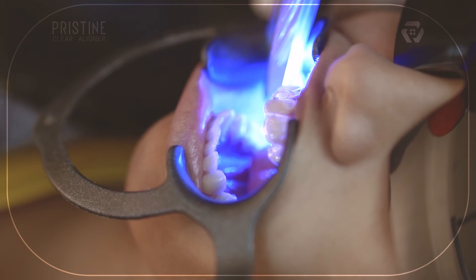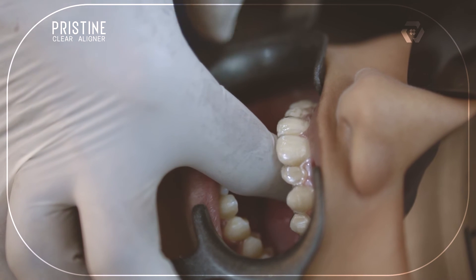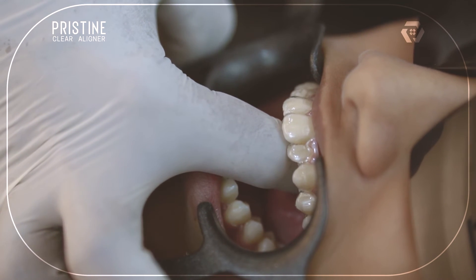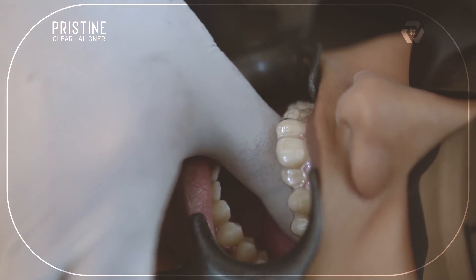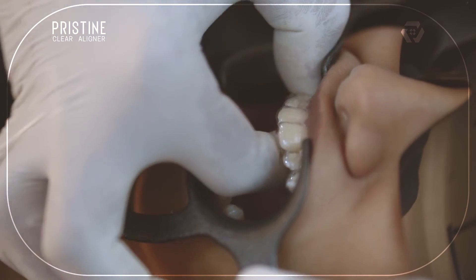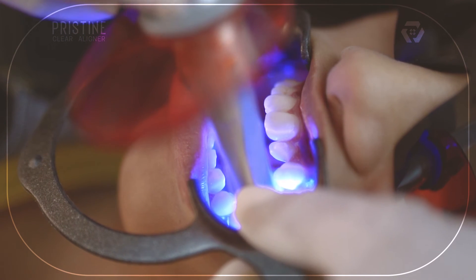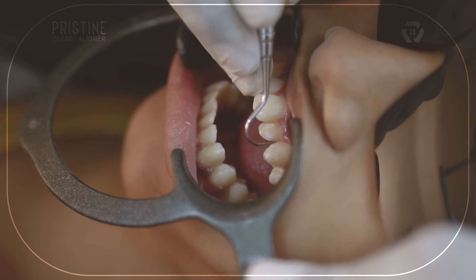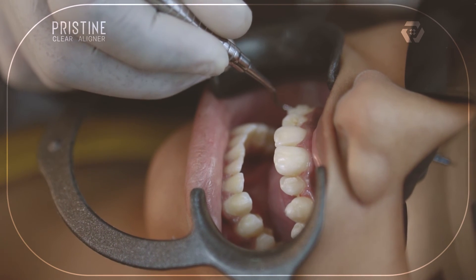Now cure it. After curing, start removing the template from the posterior-most area and from the palatal or lingual side. The softer sheet may come off more easily. Remove any overflowed composite, especially in the interdental area, because composite there may interfere with tooth movement. It can be easily removed with probes.